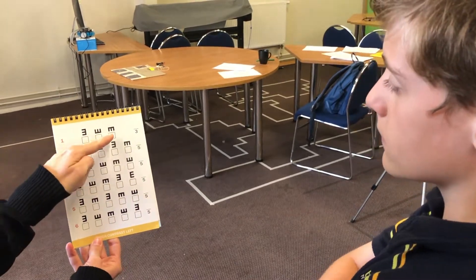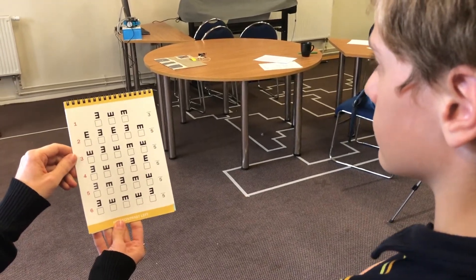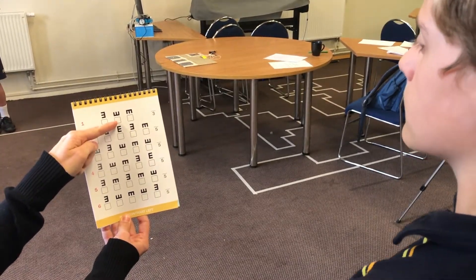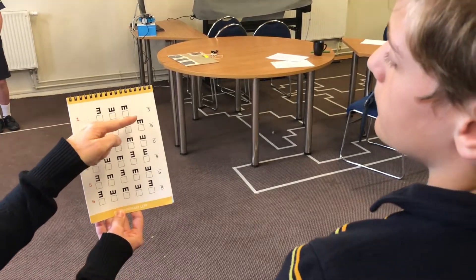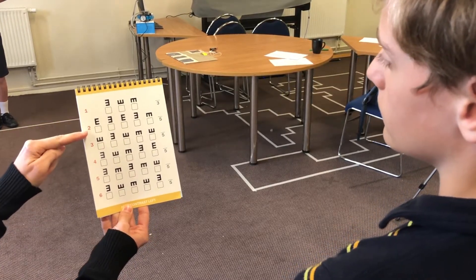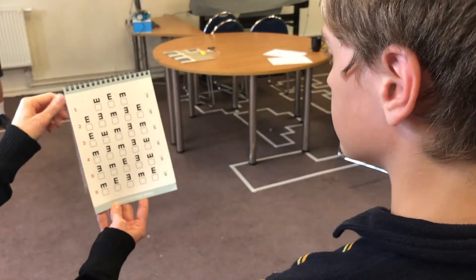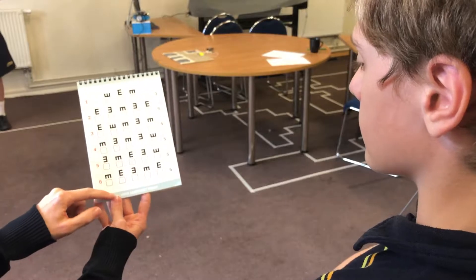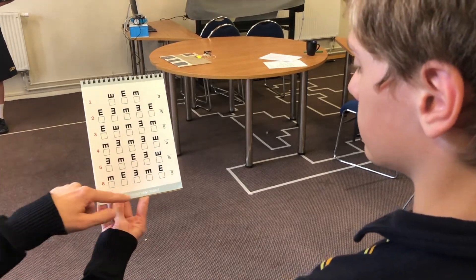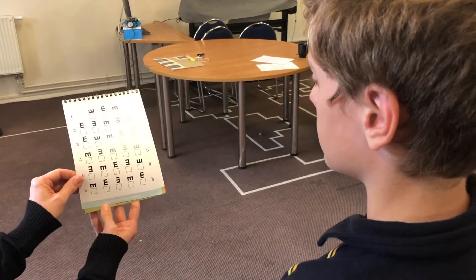You've got some boxes to tick across if they get the answers correct or incorrect. Add up the total number of ticks in the box at the end, test all rows, and repeat for all charts. The E's on the recording sheet are facing the same direction as the E's on the chart Maddie is reading. Every time Maddie points in a particular direction, if she points the right way, tick the box; if she points the wrong way, cross it. At the end, add up the total ticks and write them — out of three or five. These colours match the colours on the flip chart itself, so you can make sure you're both recording for the same test.